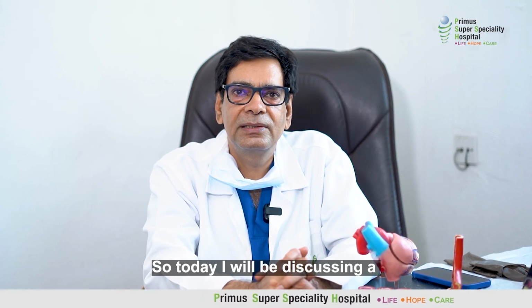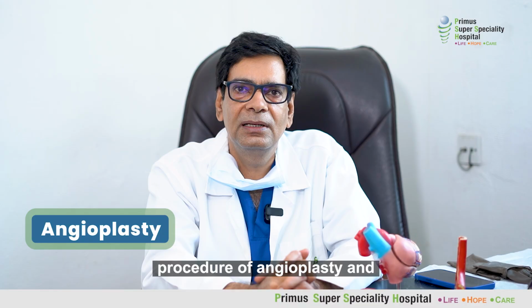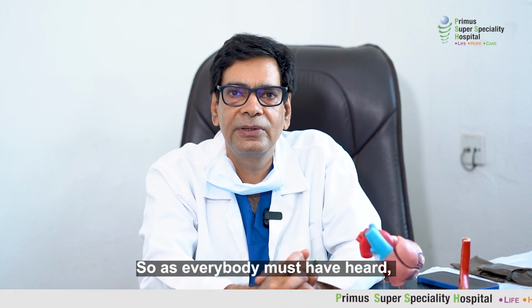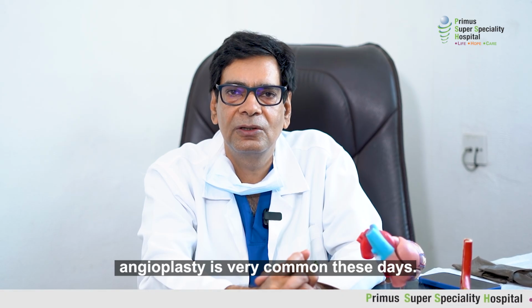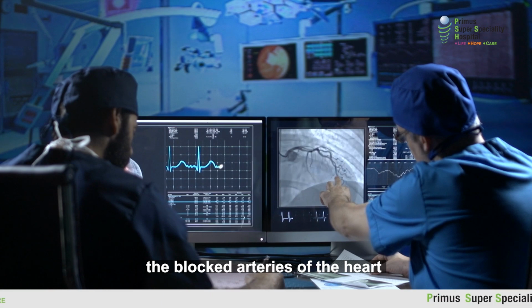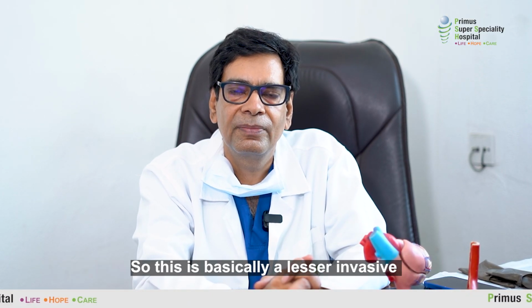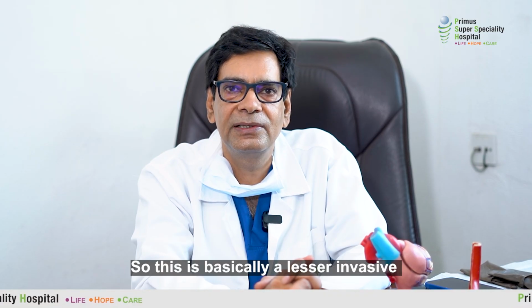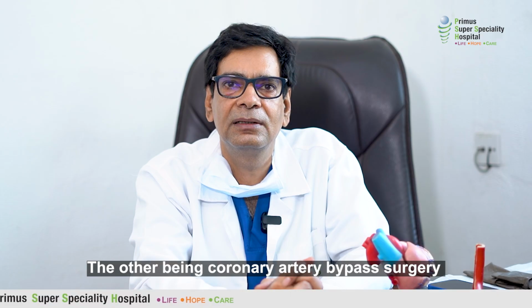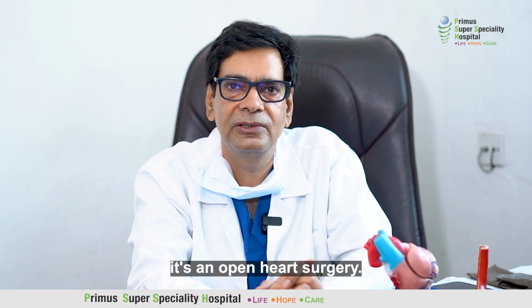So today I will be discussing a little bit about the procedure of angioplasty and what to expect after angioplasty. As everybody must have heard, angioplasty is very common these days. It's a procedure in which we open the blocked arteries of the heart without surgery, without any incision, without any stitches. So this is basically the less invasive of the two procedures to open the arteries of the heart, the other being coronary artery bypass surgery, which, as everybody knows, is an open heart surgery.